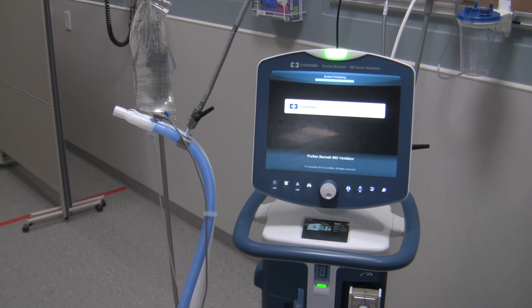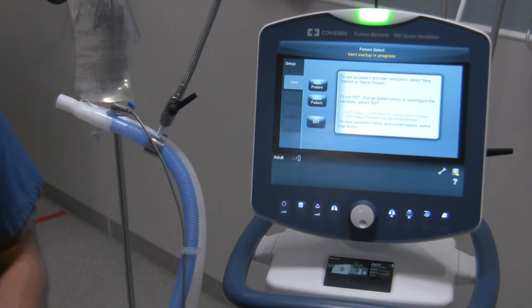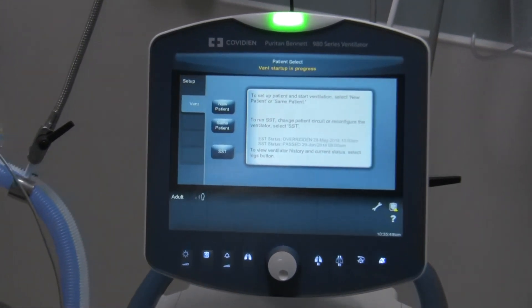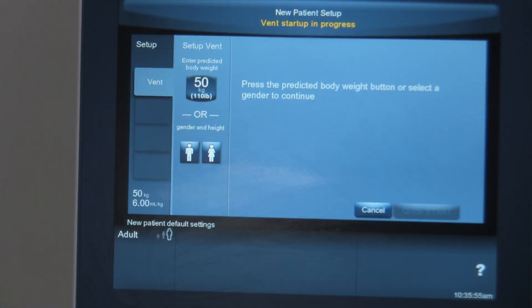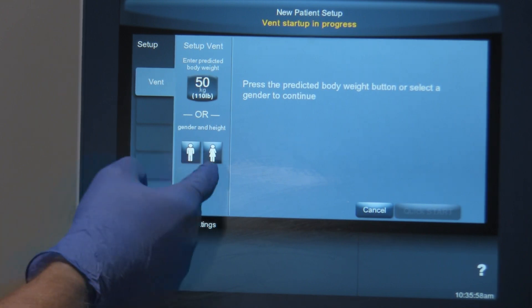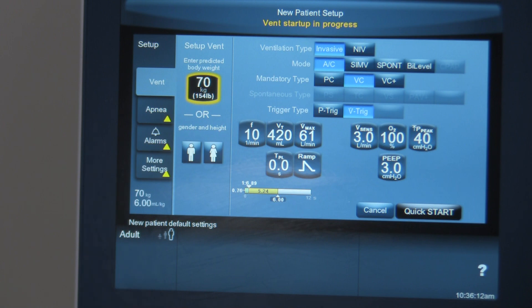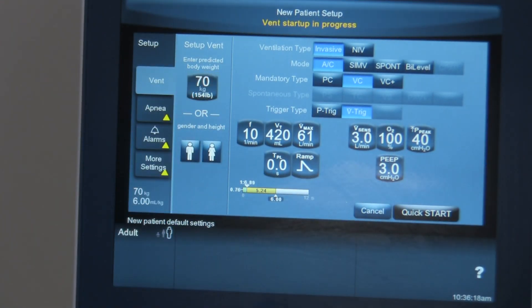You are adhering to all safety protocols and practices of your hospital — you've done the appropriate protective equipment. All you need to do now is set the ventilator up, set the alarms, and you should be good to go. We're going to choose 'New Patient.' When we pull up the new patient screen, you can choose between gender or ideal body weight. When you choose ideal body weight, it presets some values. We're going to choose 70 kilos, using the rotary knob to set the value.